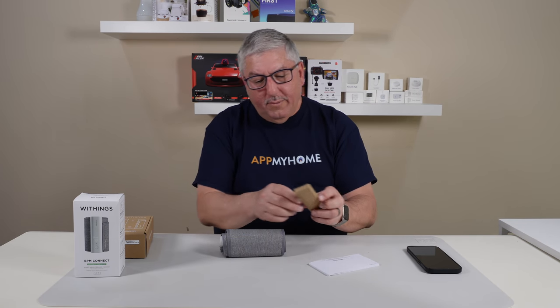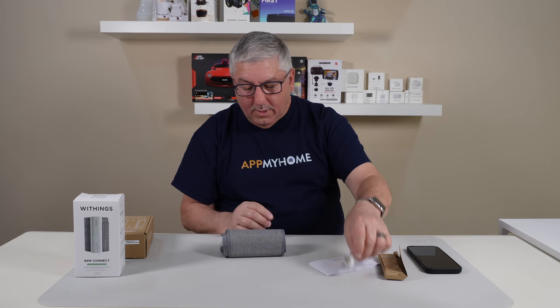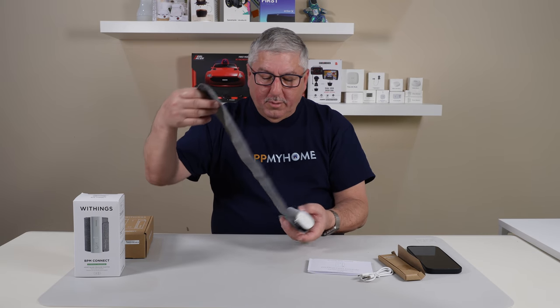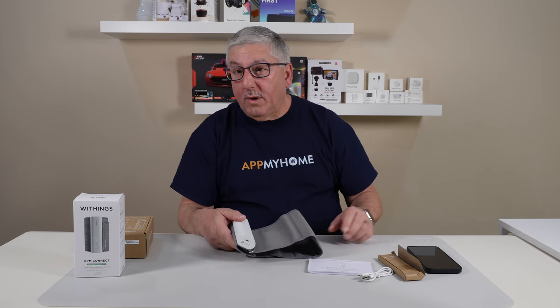Before we look at the cuff, it says this is the Withings USB cable — it's micro USB and USB-A. And the directions, and the blood pressure monitor. So that's it, it's pretty cool. Seems pretty simple; there's a little button on it and their name. We're going to give it a go.